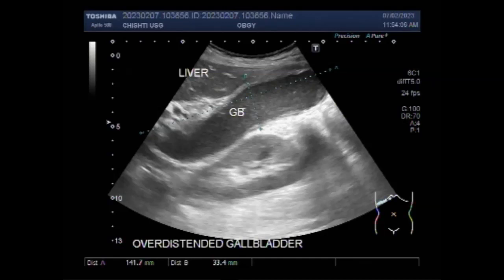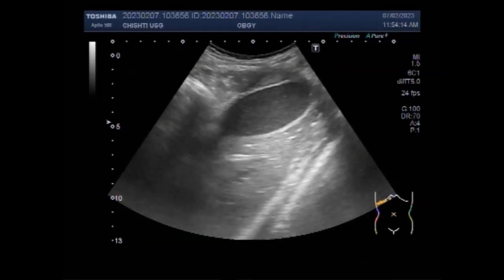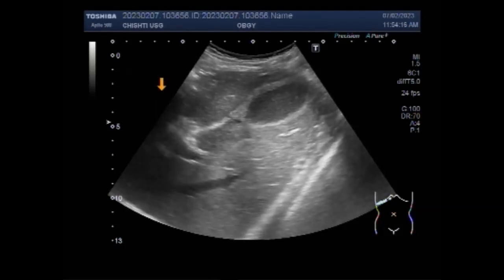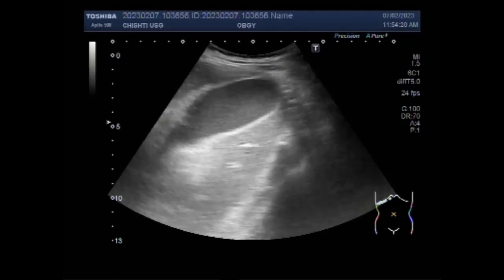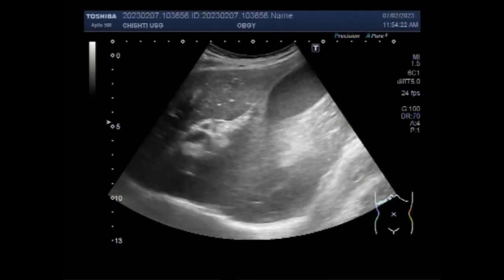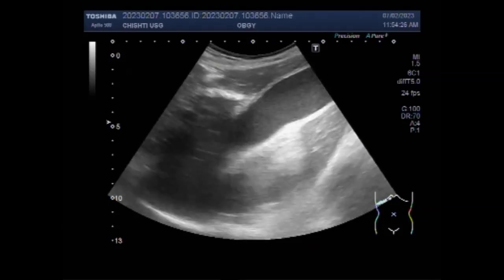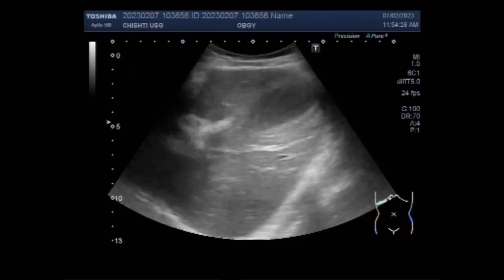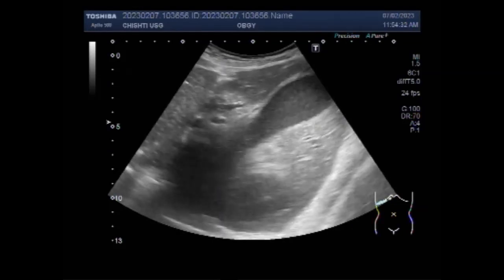Now you can see the measurement of the gallbladder. It measures 14.2 by 2 cm. You can see the thickness at the neck of the gallbladder and thick mucus accumulated throughout the whole length, along with a large stone impacted in the neck.